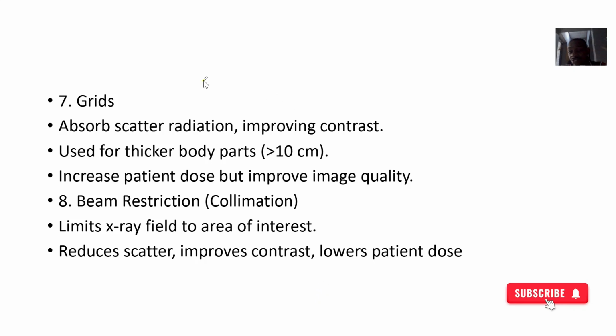You can also use grids, okay, to absorb X-rays that are scattered and channel them to one place. Do you understand? So it will increase the patient dose, but you actually get an image that is very clear, rather than not having a clear image and having to do another imaging.